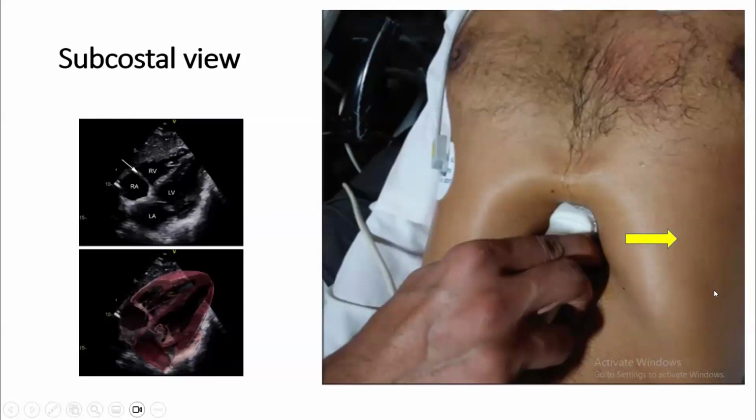The subcostal view is very important. From my personal experience, I started to learn the subcostal view first. Why? Because it is very important in intensive care, in emergency, in the ER, in CPR, everywhere. Why? Because you often don't have access: there are many electrodes here, the chest is splinted by mechanical ventilation, the patient has had surgery, or the patient is receiving CPR here.